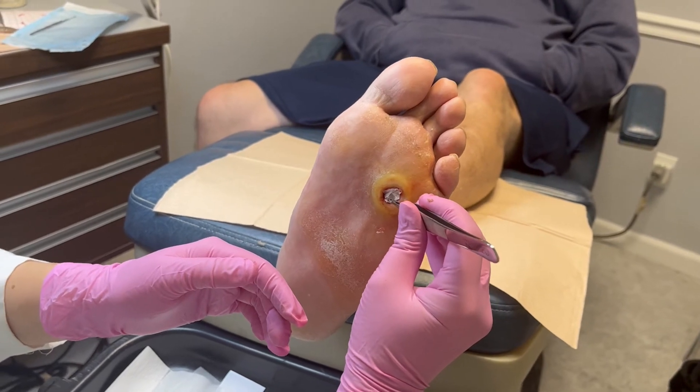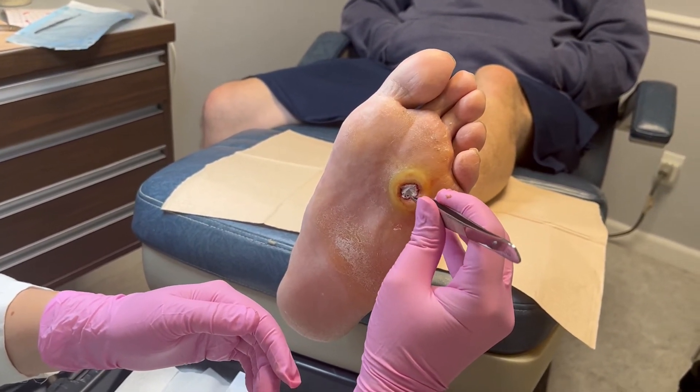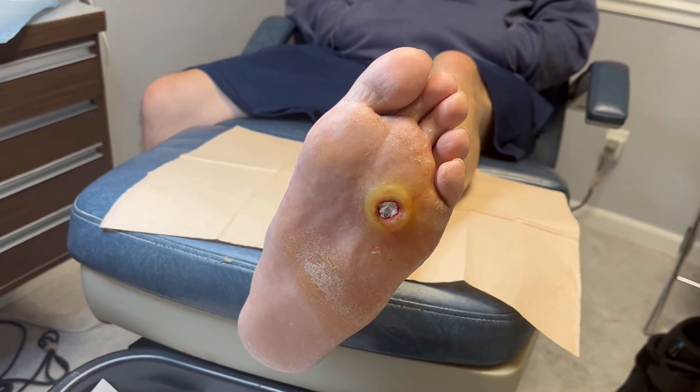I'm going to put a non-stick bandage on this with some compression, and then we'll be back here next week.